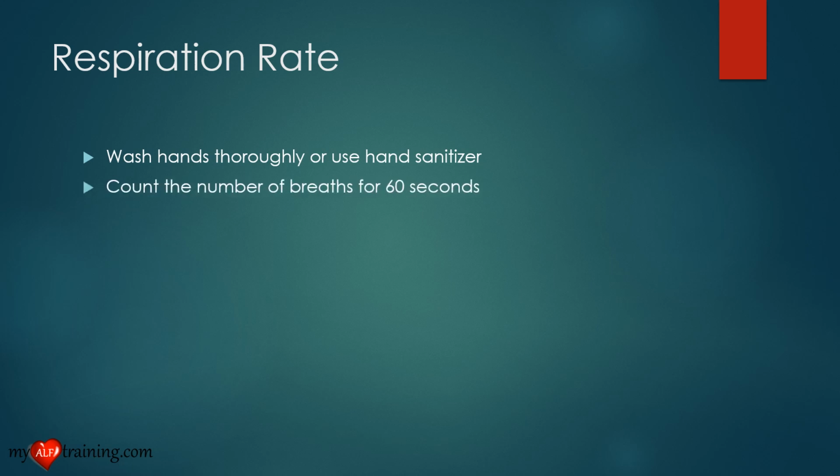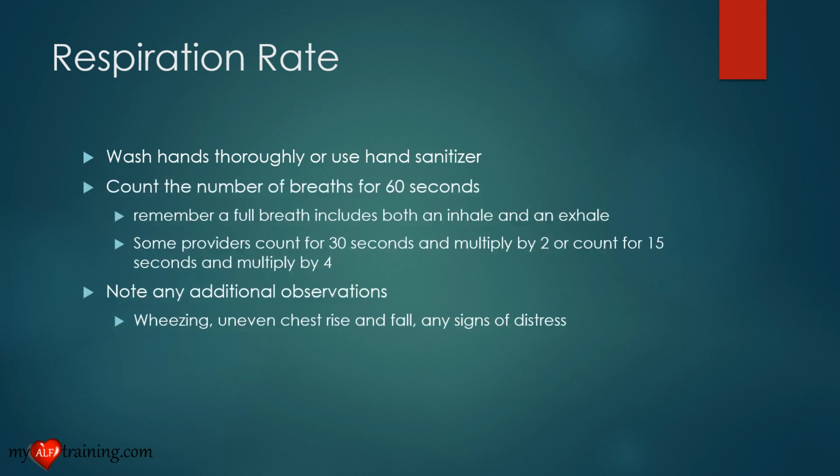The first step in assessing our respiration rate is going to be to wash our hands thoroughly or use hand sanitizer. We're going to observe the patient breathing and count the number of breaths they take for 60 seconds. Please remember a full breath includes both an inhale as well as an exhale. And also remember that some providers count for 30 seconds and multiply by 2, or they will count for 15 seconds and multiply by 4.